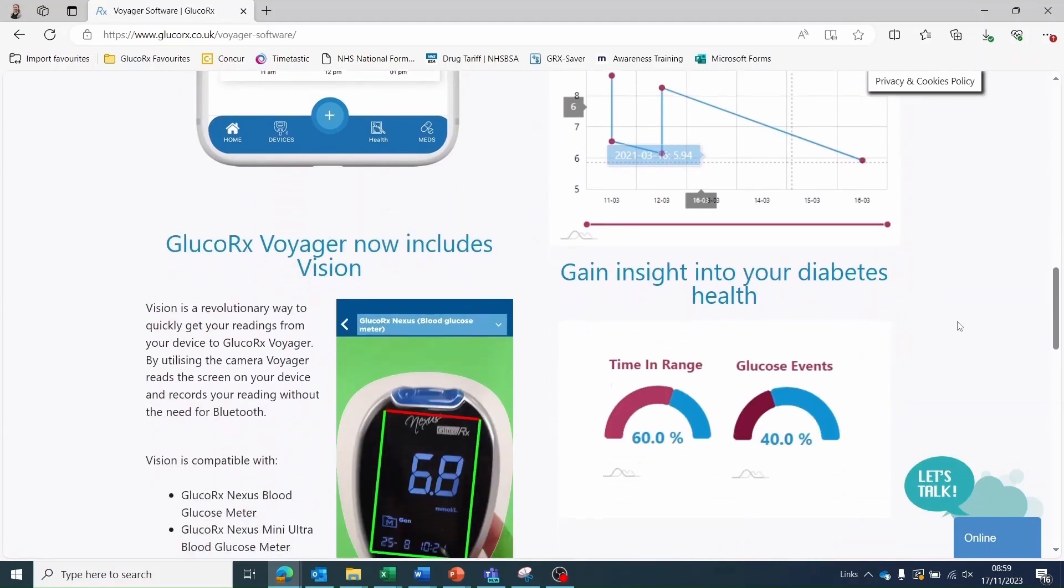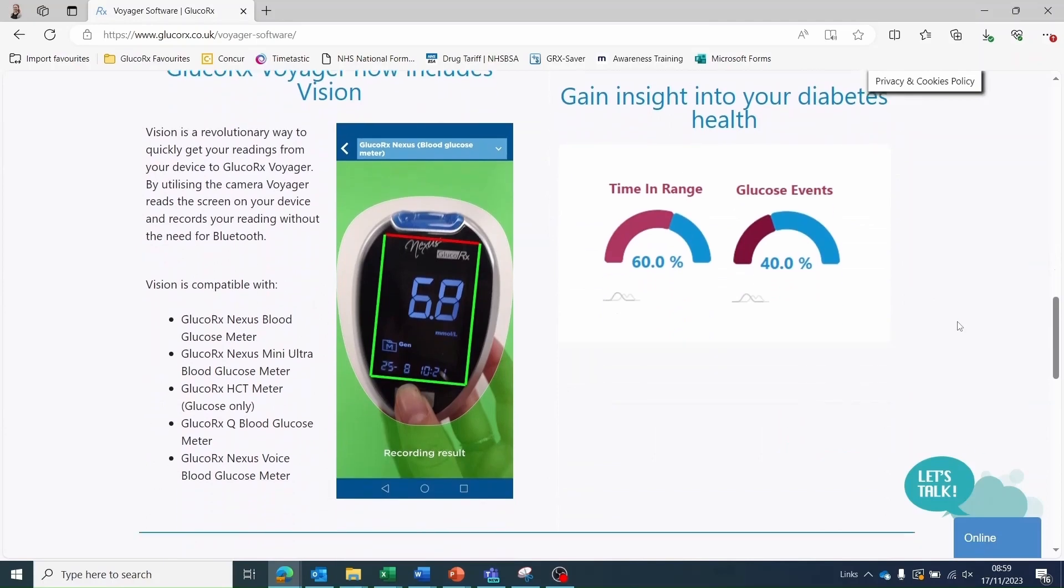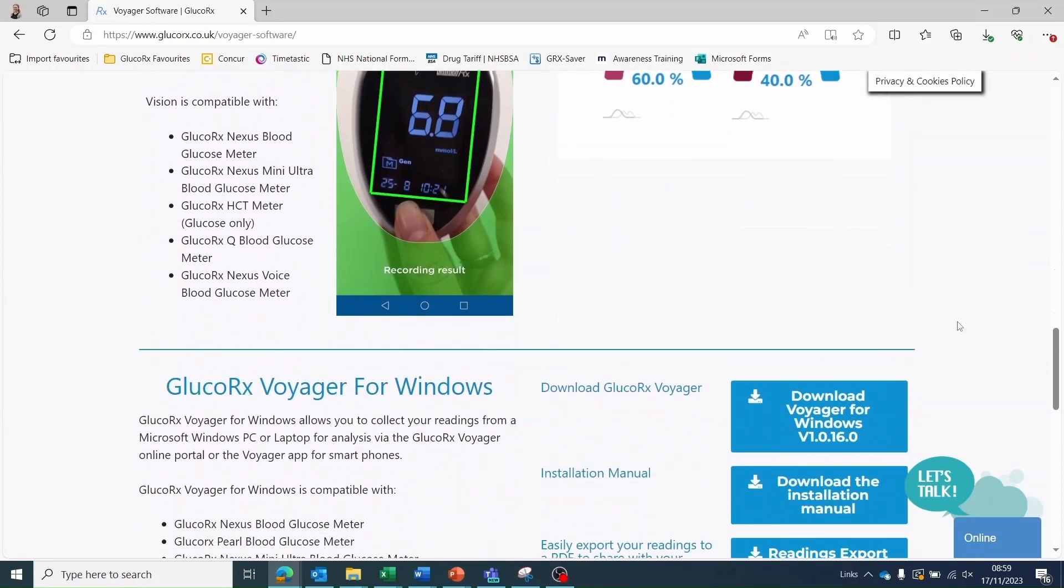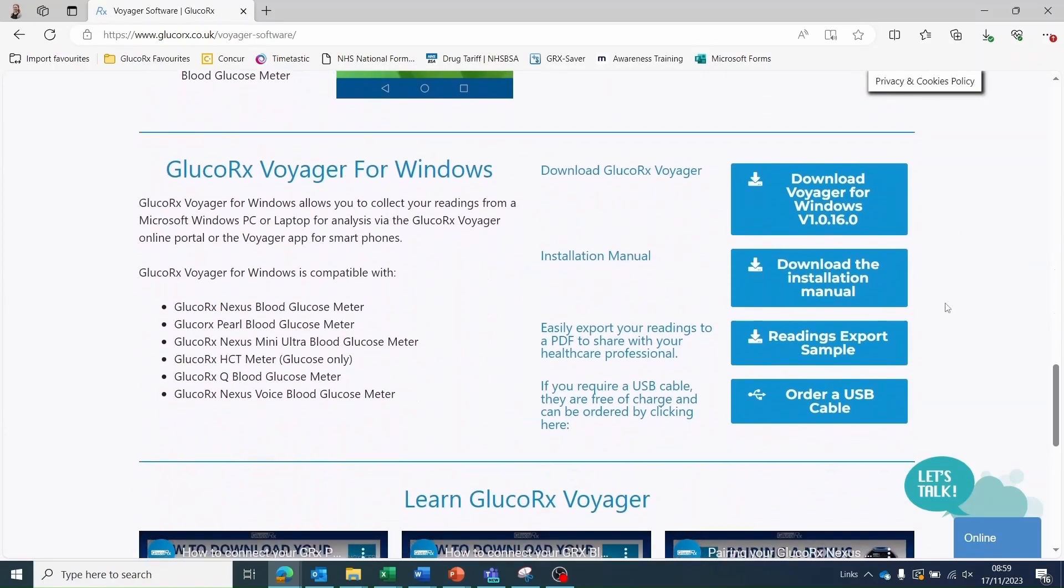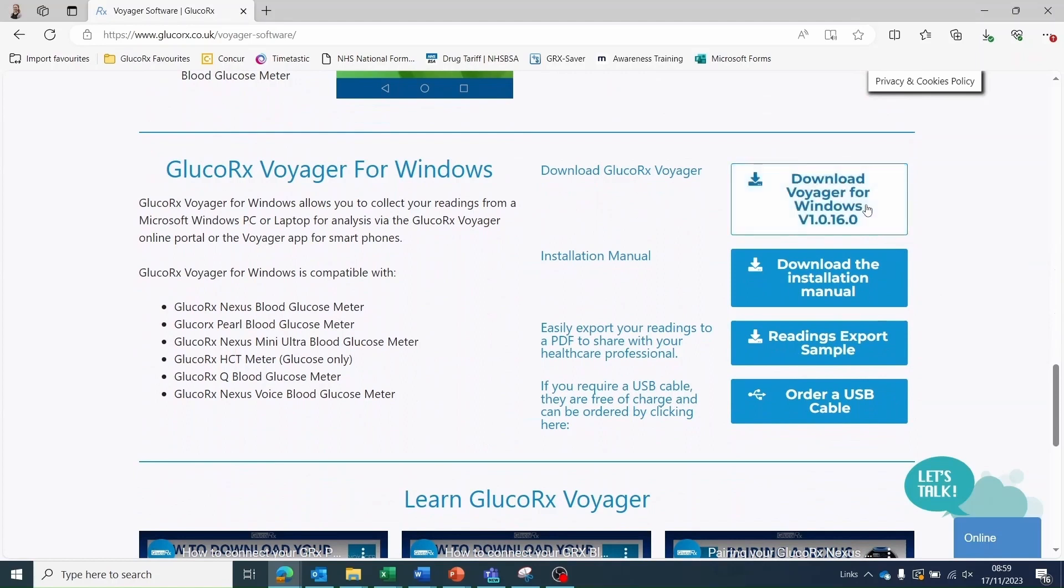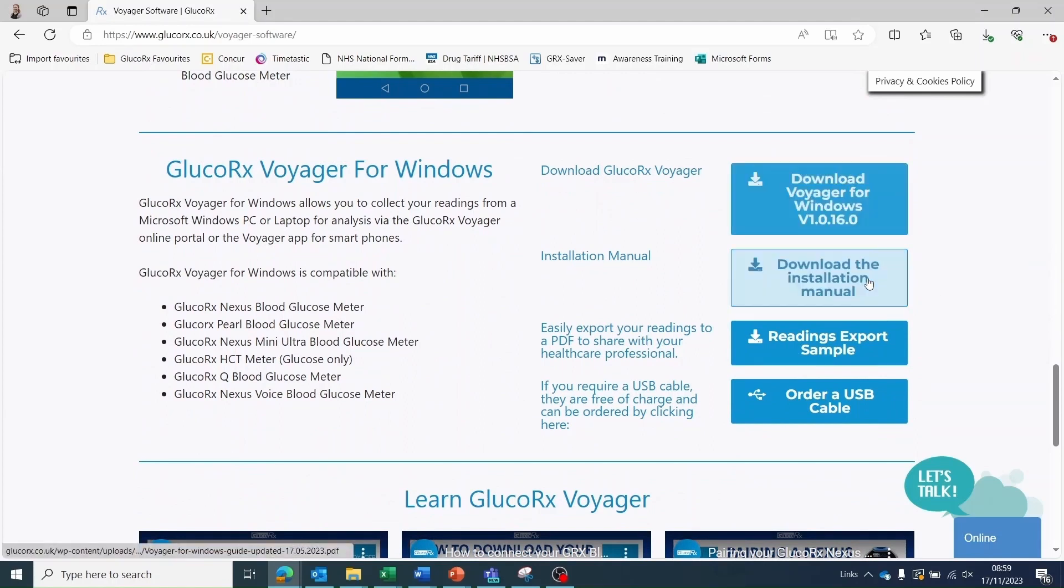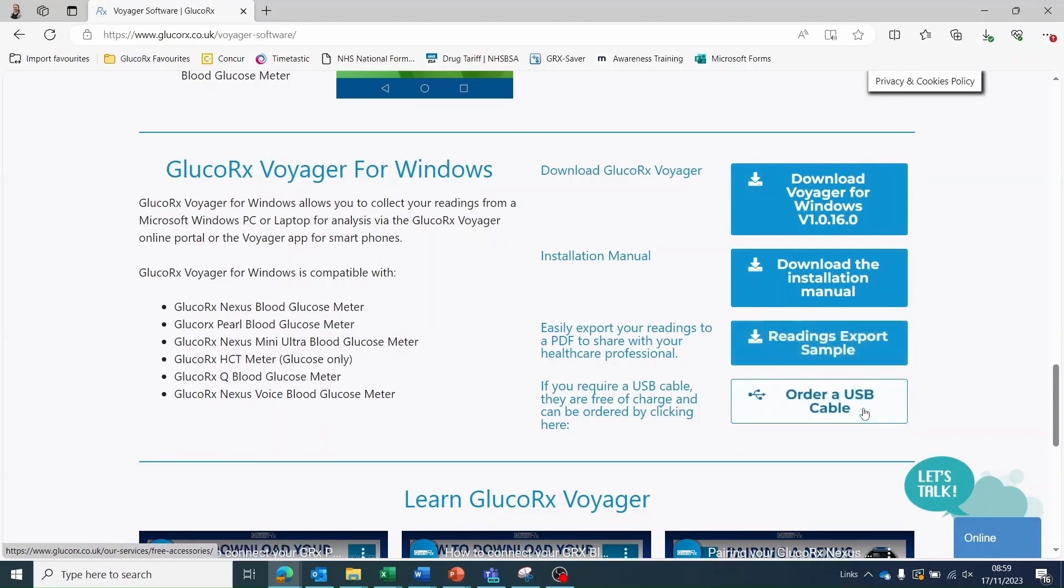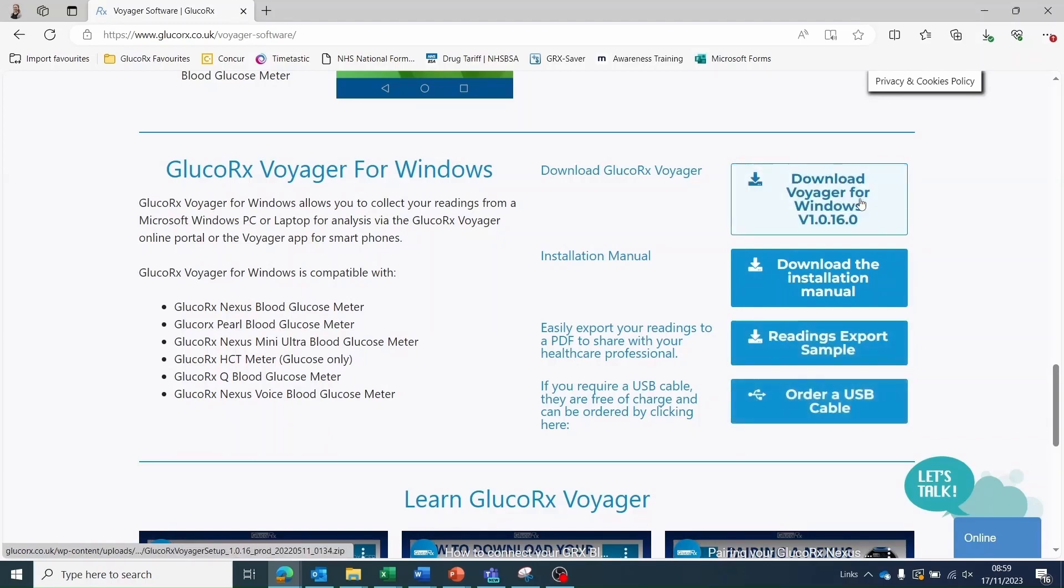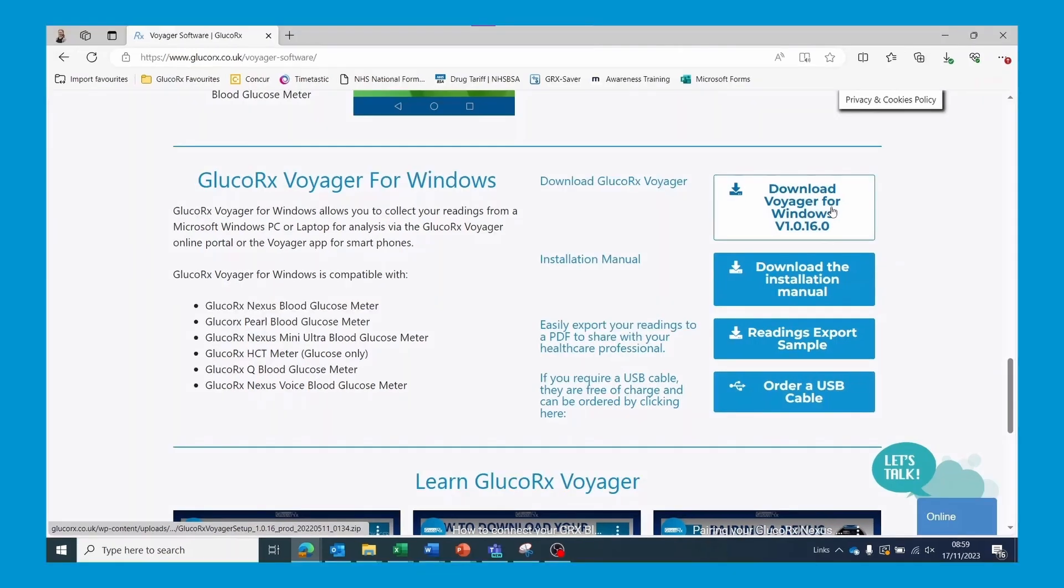To download the GlucoRx Voyager software onto your computer, scroll to the GlucoRx Voyager for Windows section. Here you can download Voyager for Windows, view the installation manual, view an example of exported readings, and order a free USB cable from GlucoRx.